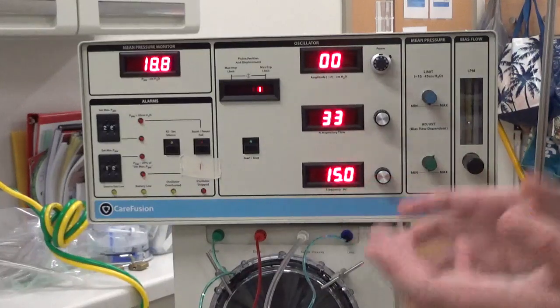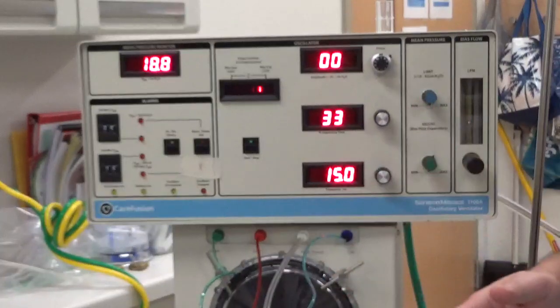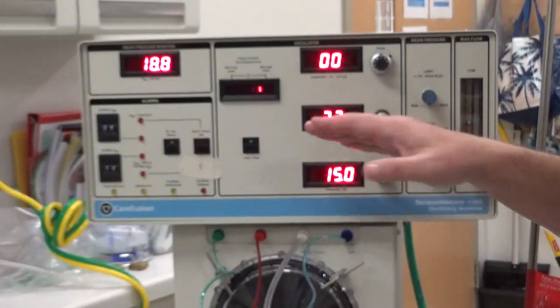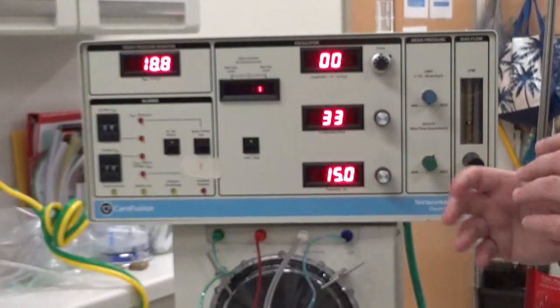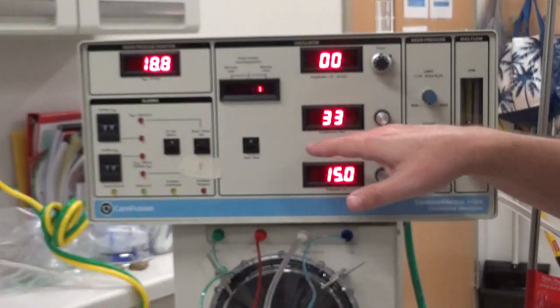If we are at 15, we're at 900 breaths per minute. As opposed to a ventilator, which is about 40, and a jet's about 300 to 420. And I time is 0.33. It pretty much stays at 0.33. You sometimes can turn it up to 0.5, but we hardly ever do that, so I wouldn't even worry about that right now.